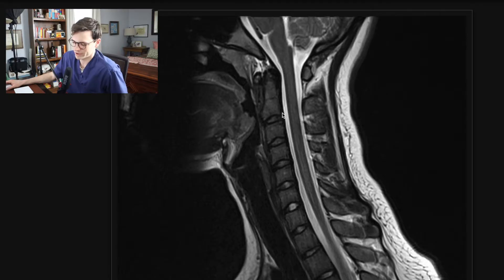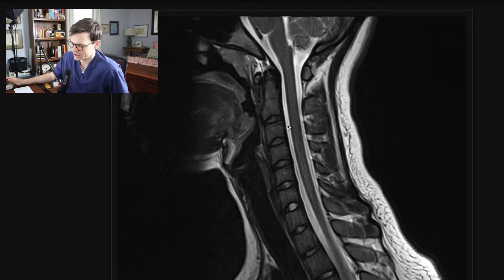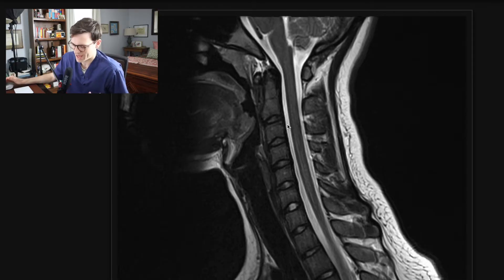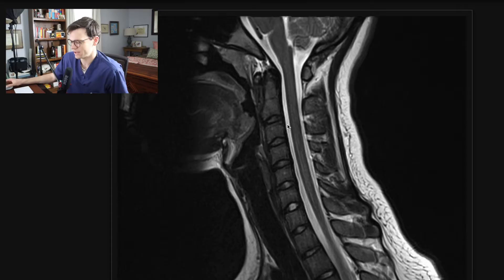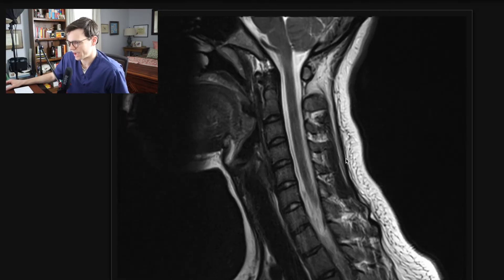The canal is a place where you don't want to miss something, because a lot of significant pathology happens within the canal — particularly the epidural space, which is where you'll find phlegmon, abscess, or potentially epidural hemorrhage. Epidural hemorrhage can happen in the setting of trauma, but also spontaneously, particularly in patients that take anticoagulation medications. In this case, this is a normal cord and a normal canal.